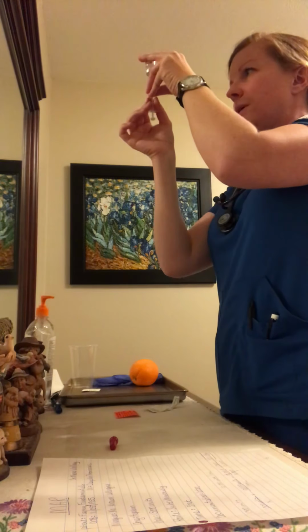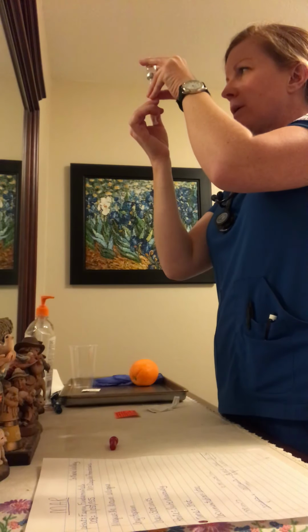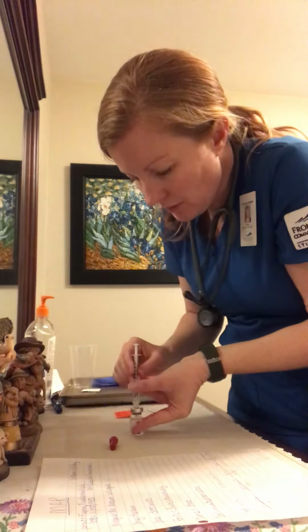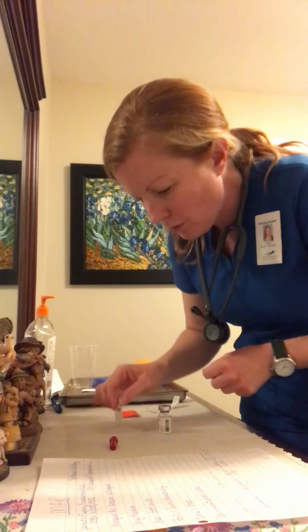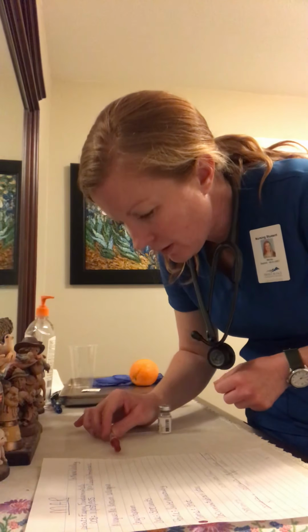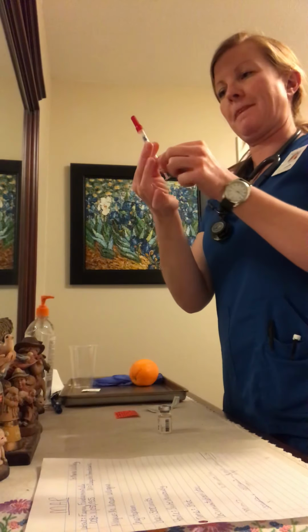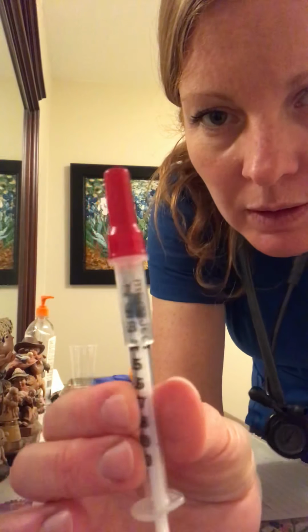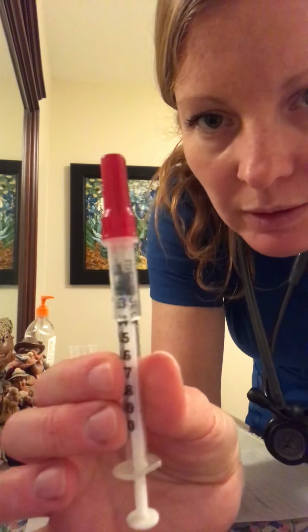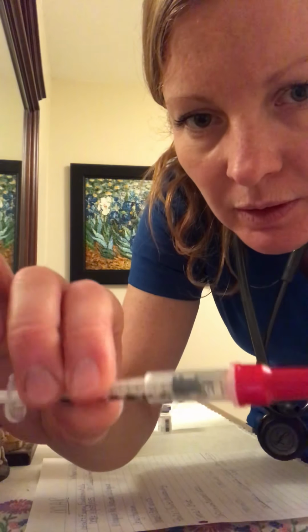Okay, looks good. We have 0.13 milliliters of heparin. So I'm going to take it out and I'm going to scoop it up, the cap up, without touching it. Scoop. And I'm going to place the cap on there. So I'll show you, maybe you can see the 0.13. It's very small. It's hard to see.